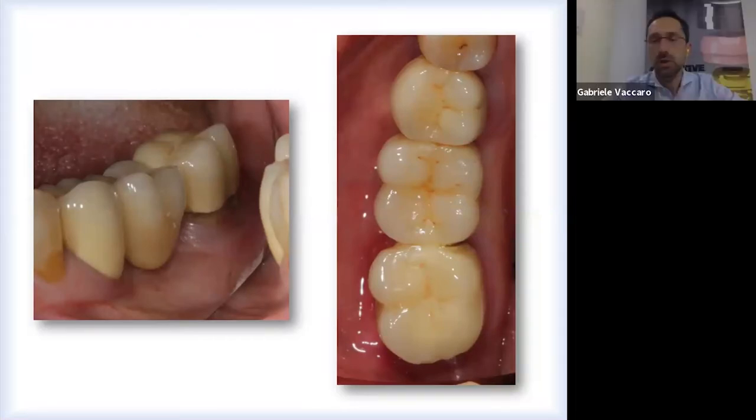As Marco said, just follow the recommendation of your implant brand company. If your implant brand company says 25 torque, then you screw your equator over your implant at 25. Don't exceed 25 torque in any case, because you can produce damage to the screwdriver engagement. And the secondary screw, the small screw, must be screwed at no more than 10-15.